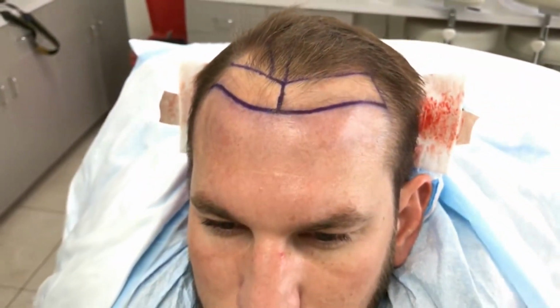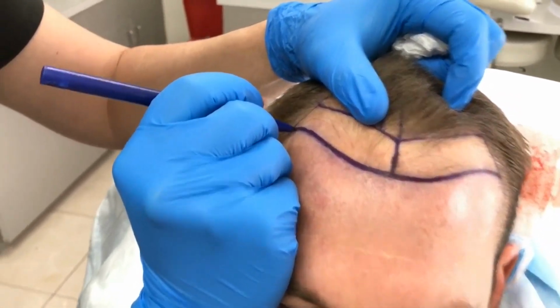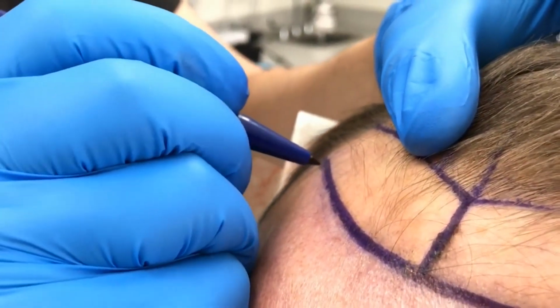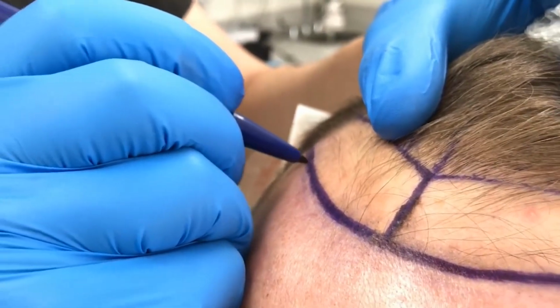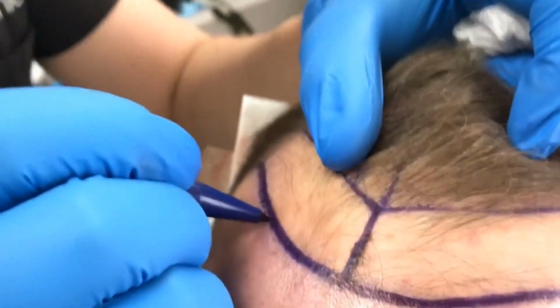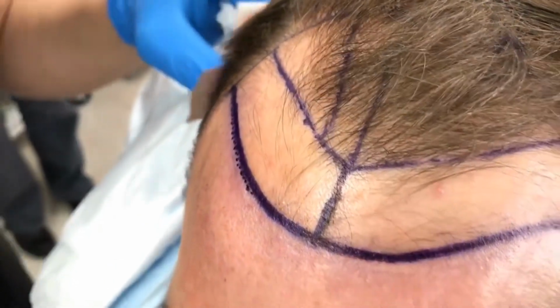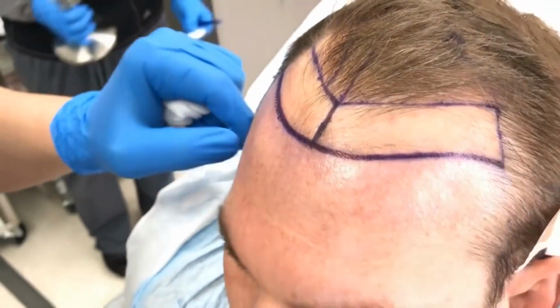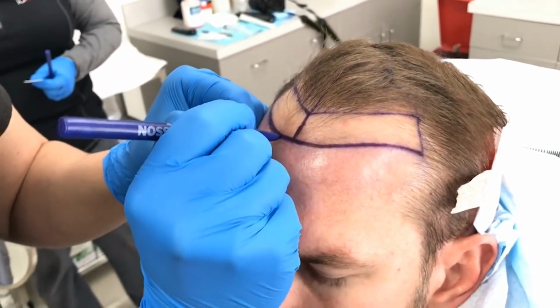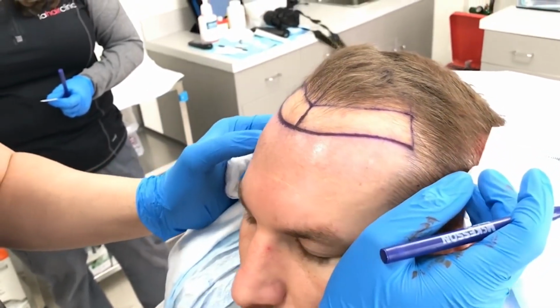Perfect. Okay. So now we're going to place the irregulars in the very front, okay? So this is what's going to give your hairline a nice soft transition. And we want to place all the singles in the very front, a few rows, and then all the multiples behind it for the density. Turn a bit this way. Perfect.